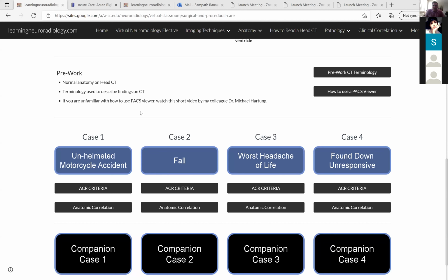That is a hard question to answer because it's a very expansive question. In terms of the gist of how to approach, first you need to have a good understanding of the basic anatomy of the structure you're looking at. It's only through that that you can really understand when something is wrong. So you have to refer to basic anatomy. Even today, after so many years, I go back and look at pictures all the time when I see these scans, because you need to be very familiar with the basic anatomy, and that is critical when you make this kind of diagnosis.